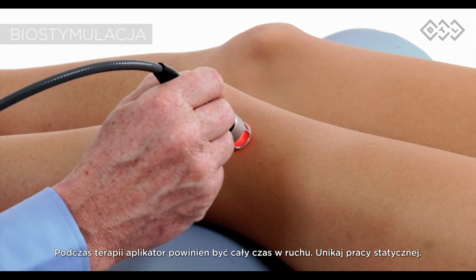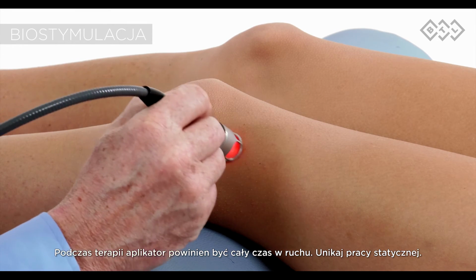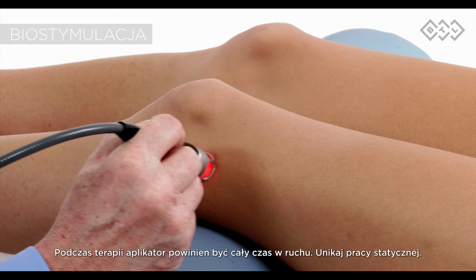Move the applicator continuously at medium speed. Prevent static application in order not to overheat the area.